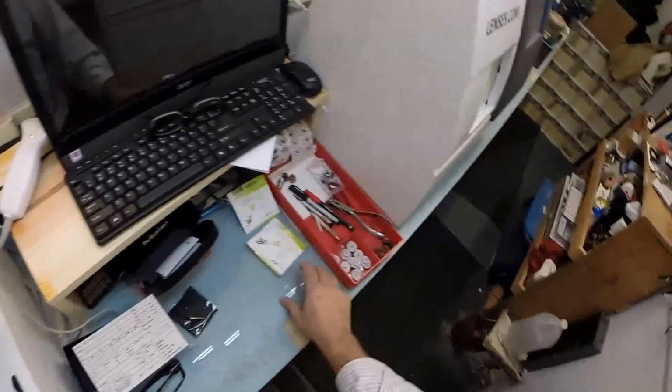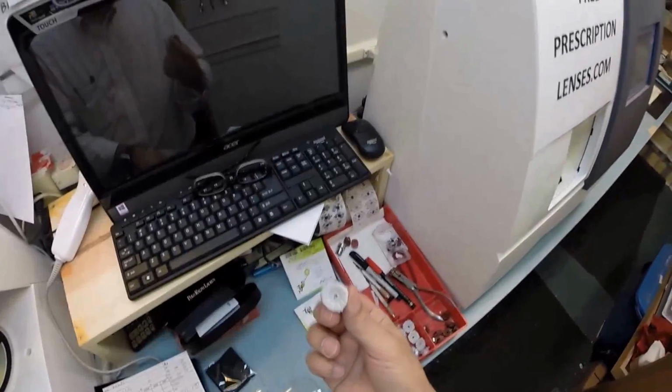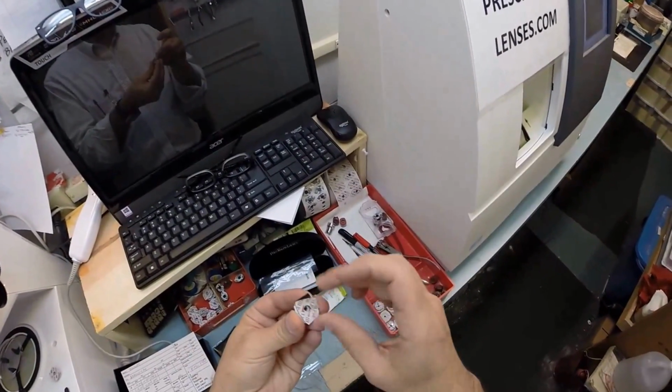I'm going to go ahead and block your lenses. When I say block, this is a block, or as I like to say, Jenny from the block. This is what's going to attach to your lens and hold it in place while it is cutting. So I need to apply a double-sided adhesive sticker to that, of which I have already done. I'm going to pull the paper away to expose the second side of the sticky pad.